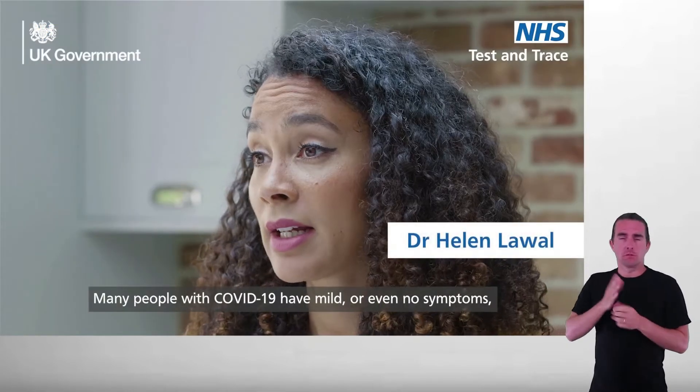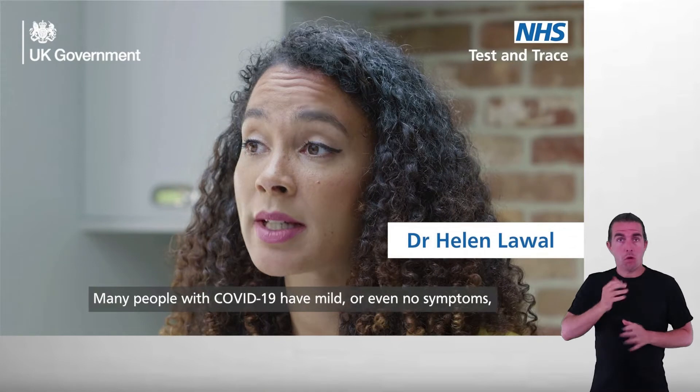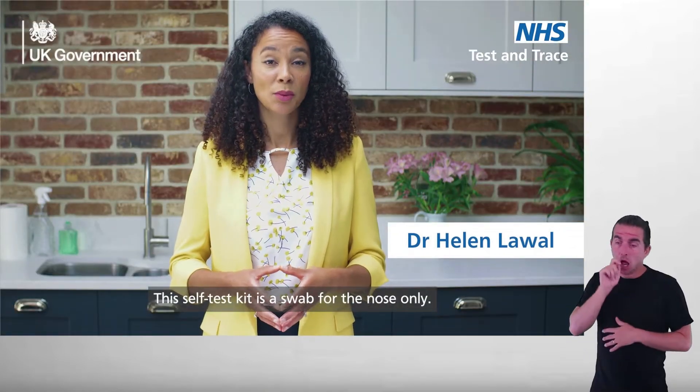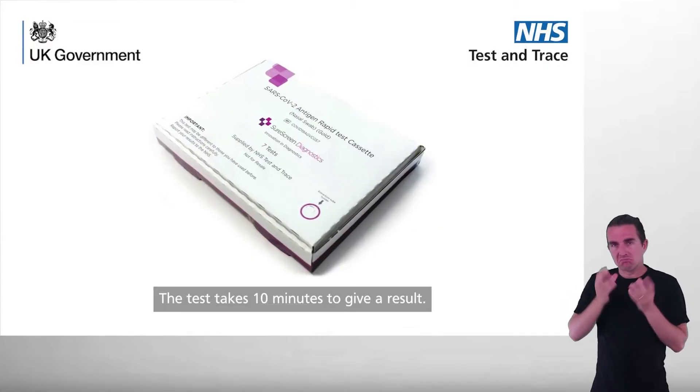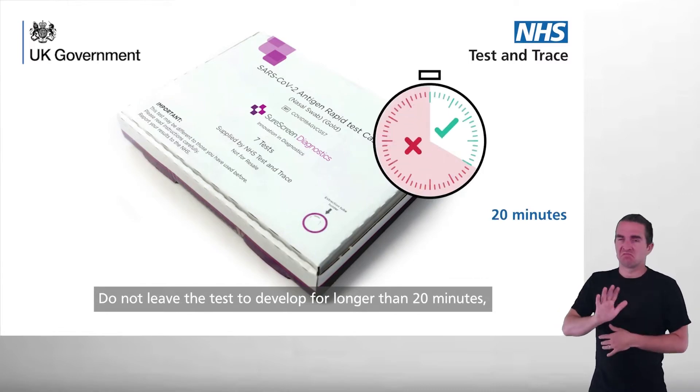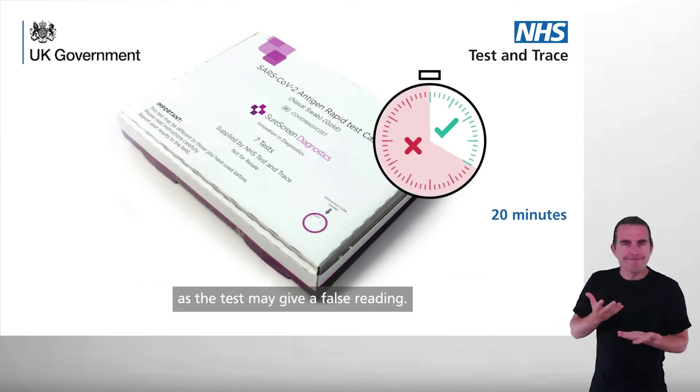Many people with COVID-19 have mild or even no symptoms but can still spread the virus. This self-test kit is a swab for the nose only. The test takes 10 minutes to give a result. Do not leave the test to develop for longer than 20 minutes as the test may give a false reading.